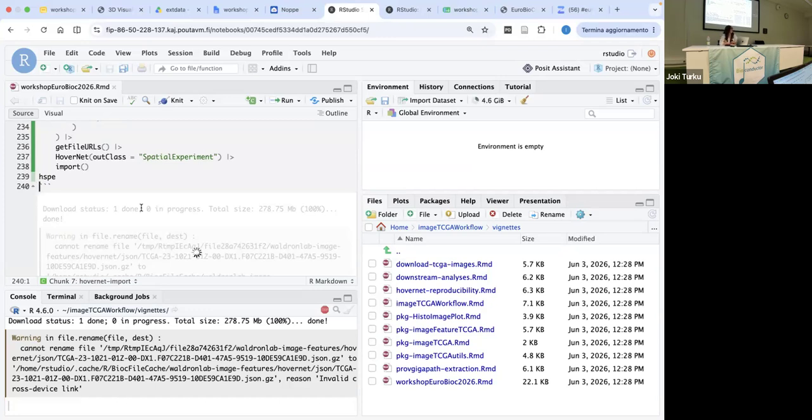Good question. You have your own data that you pop into this model. Is there any sort of pre-processing that has to be done? Like, I work in mammograms, so there's a lot of reshaping, stratifying. Does the same thing apply here?